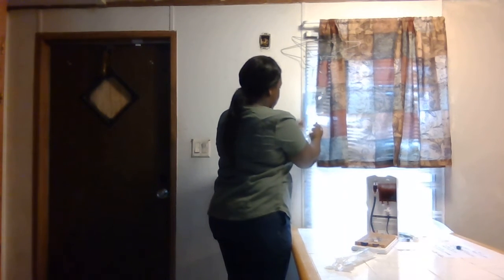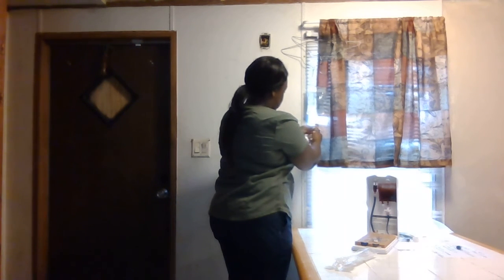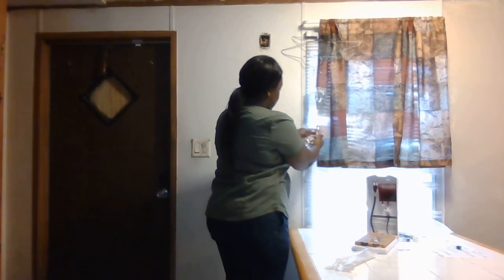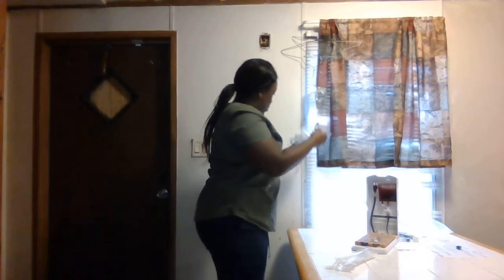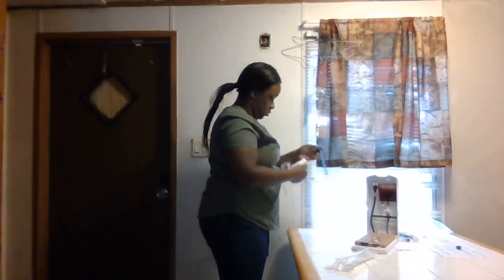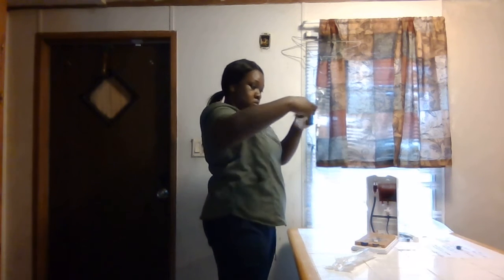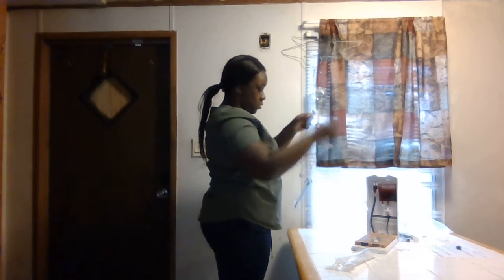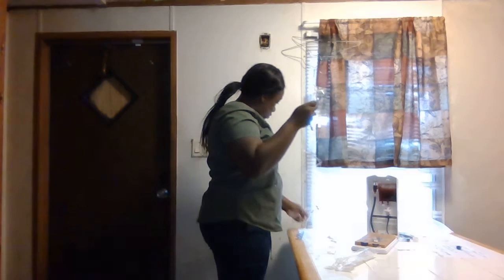Yep, twist, push. Then you want to get some fluid in this chamber. About half full. Okay. Then we want to run our line. Okay.